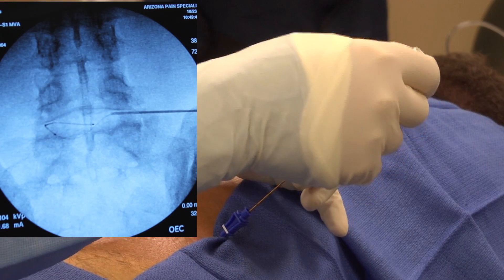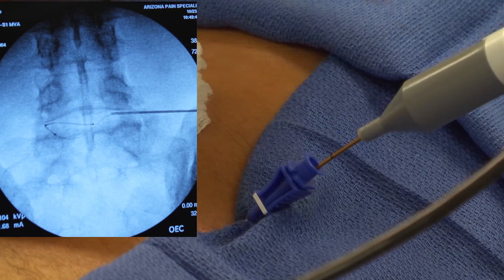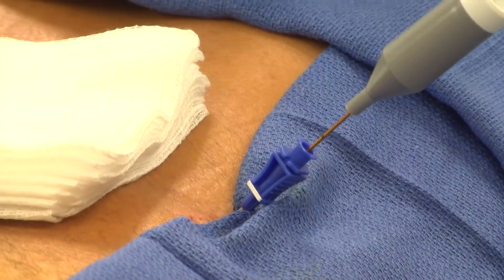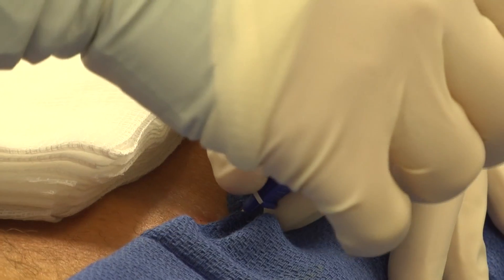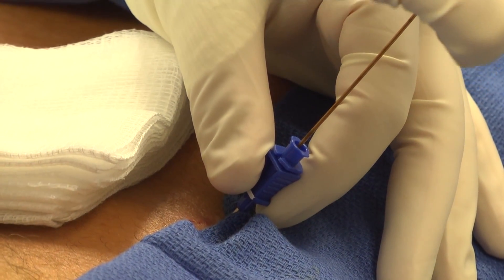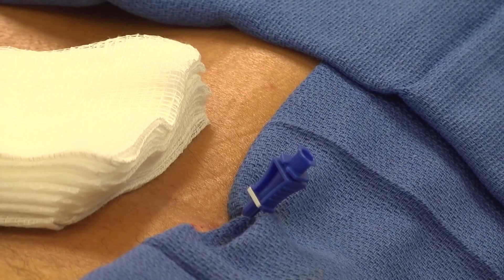After the needle position is confirmed, a catheter is advanced around the inside of the disc. The temperature of the heating catheter is increased to about 195 degrees. The heat shrinks and repairs the tears in the disc wall area. Small nerve endings are also burned to make them less sensitive. This procedure generally takes less than an hour to complete.